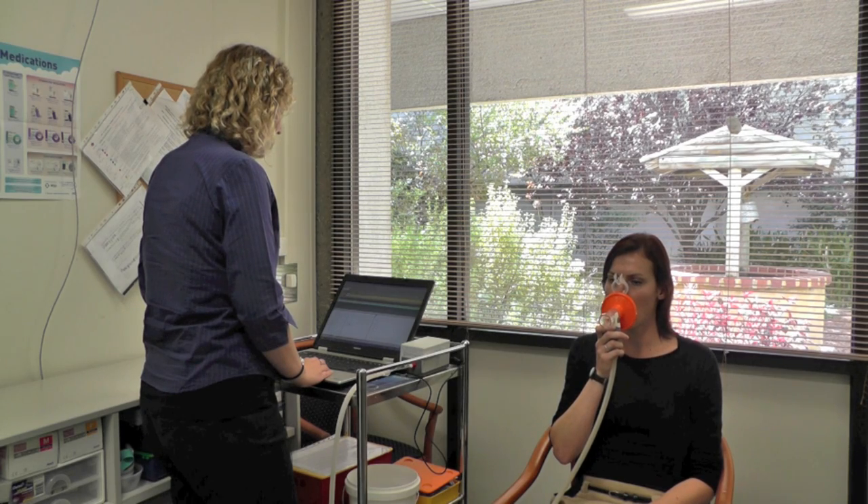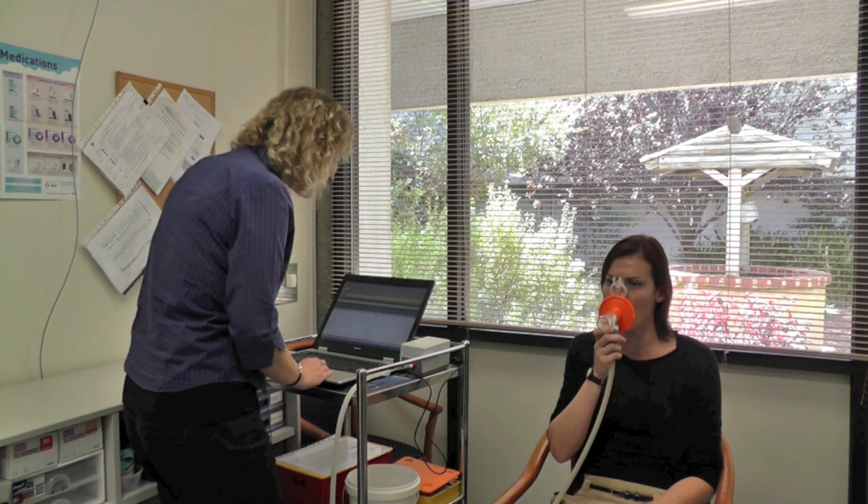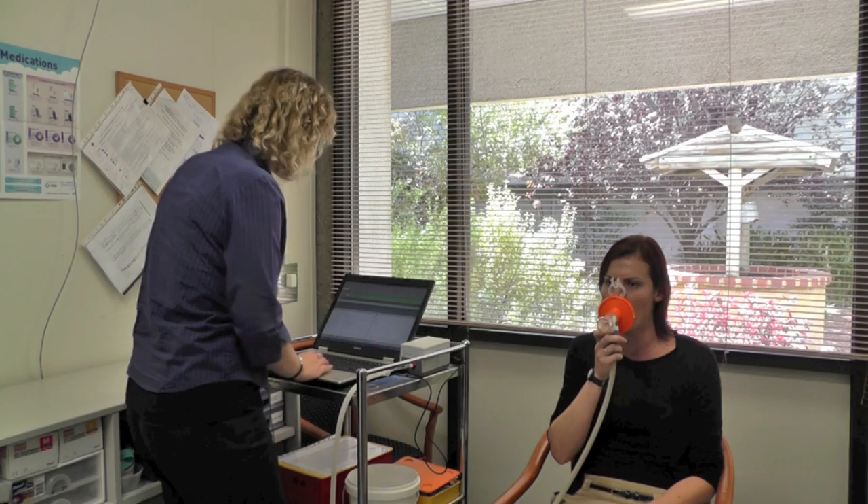Whenever you're ready, I want you to take a nice, deep, sharp breath in and blast it out. Keep going, keep going, pushing, pushing, until you've got nothing left at all in your lungs. And when you're done, you can just come off the mouthpiece.